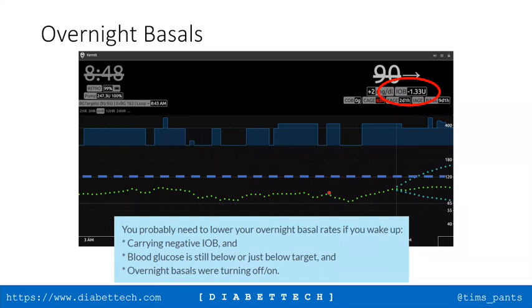I would want to do some traditional basal rate testing, switch the loop off and check that my basals are correct first, I think, before I looked at DIA. Yes, definitely you should do the basal testing, but if you have exactly this example, it's the problem of basal or it's the problem of duration of insulin action, and why?